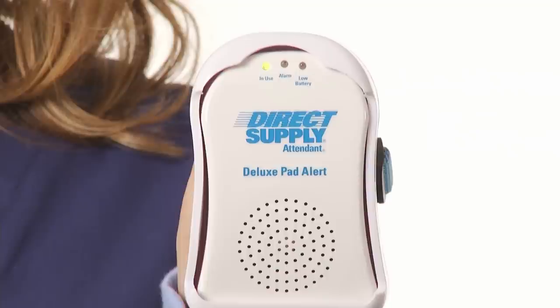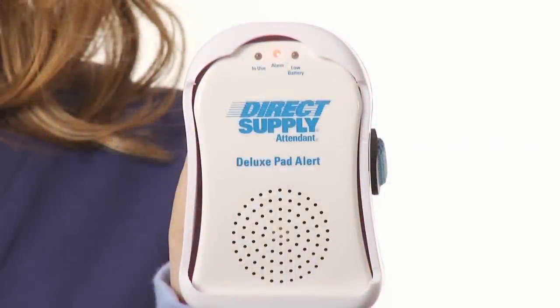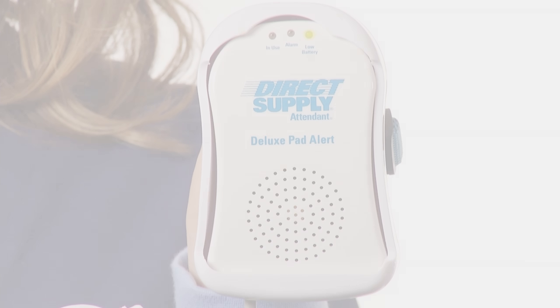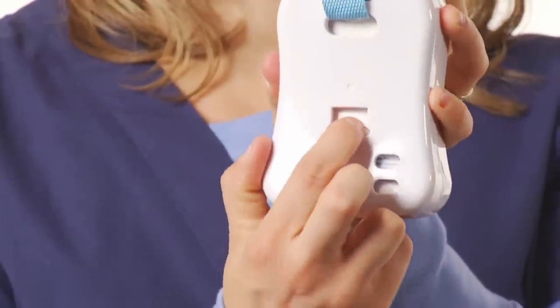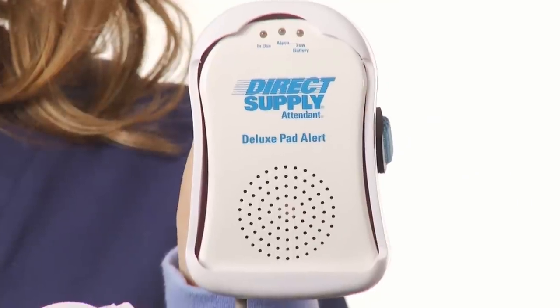An in-use light at the top of the alarm will indicate the alarm is active. The alarm light will be activated when pressure has been released from the pad and the alarm will sound. The low battery light will blink and chirp when the battery needs to be replaced. To reset active alarms on the Attendant Deluxe unit, simply press the reset button located on the back of the alarm or reapply pressure to the pad.